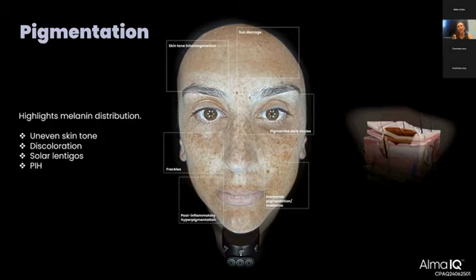When we want to analyze pigmentation, we have a better mode, which is called True UV. However, this is excellent for tracking progress. The results are very wow when you see a patient's before photo, treat them with a few treatments of Alma Harmony Clear Lift and DiBL, for example, and you will have a wow result on this image.